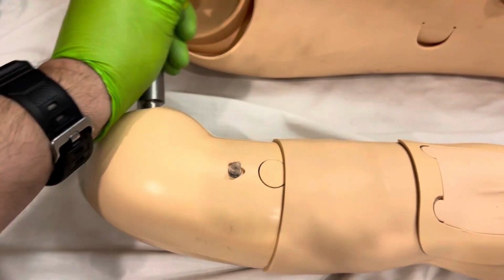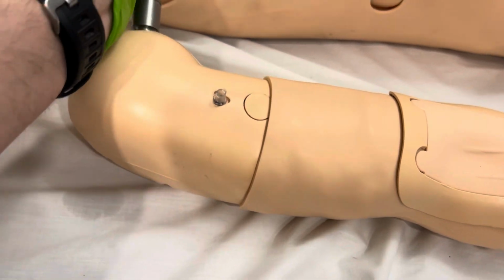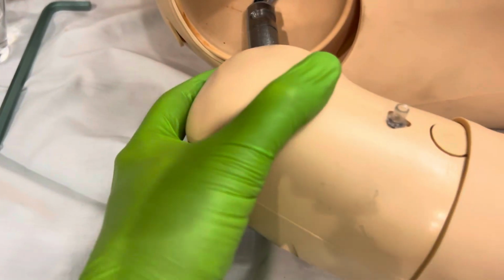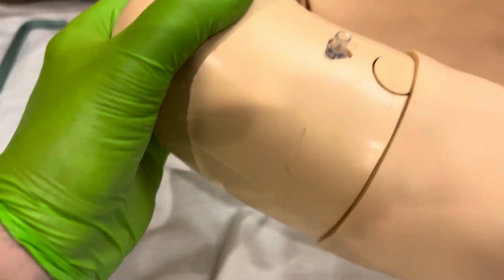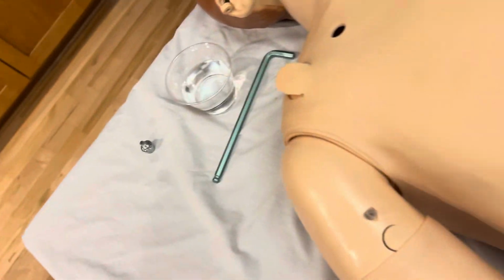Next thing we're going to do is send the 3 cables through the arm there. I'm going to get really good at doing this one-handed here. And then visualize that you're sending them through here, and make sure they're not bound up or anything. We won't need to hook up the hose anymore because we're not using that. So here we go, just the other 2 wires.